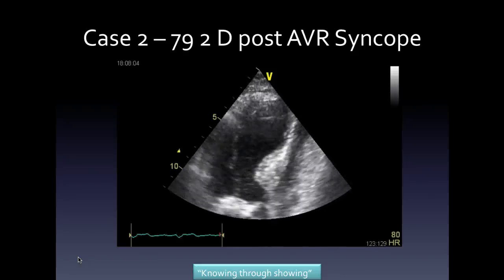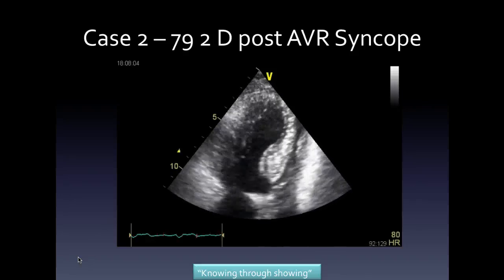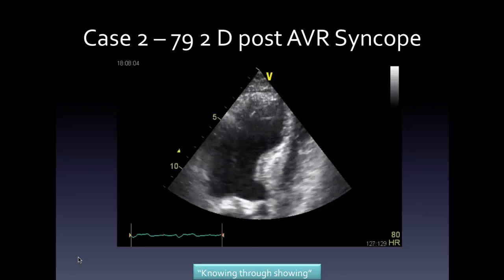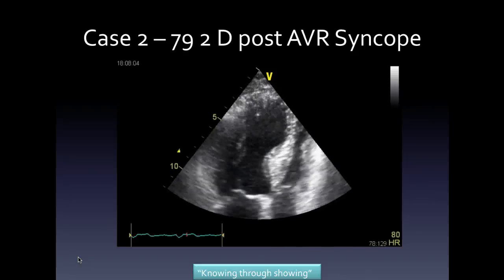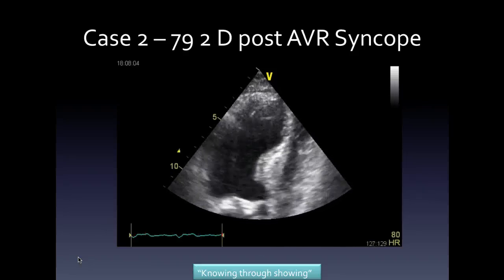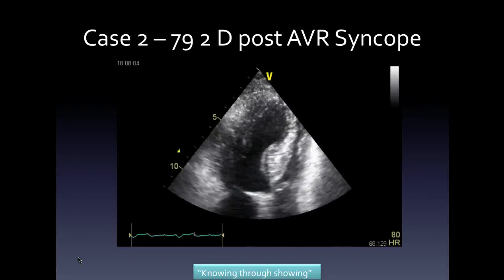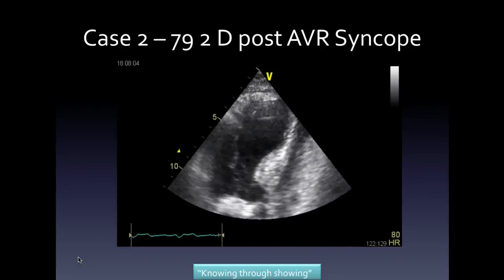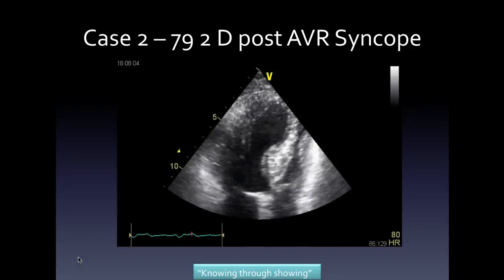So he gets out of bed and he just falls to the ground, and a cardiac arrest is called, and there's the usual confusion, and by the time everything is gathered, he's kind of saying, what's going on, what's going on? So was it really a cardiac arrest, what was the rhythm, the stickers had fallen off, his telemetry, you know. So of course an echo was done, and this is his echo. So does anyone want to make a comment on this echocardiogram? Does anyone want to be very brave and say anything about the echo?